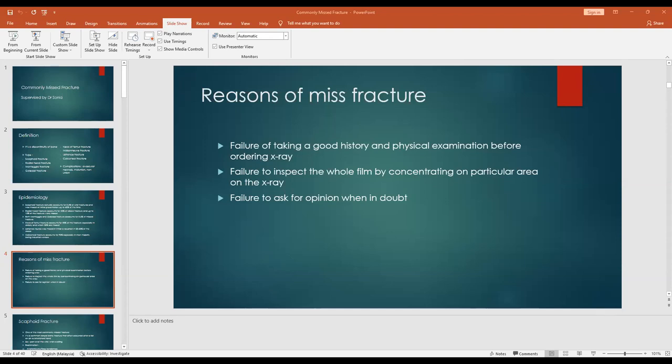Other than that, we go to the AP view. Imagine that you are driving a car across flat stones, so there is no white space between them. If there is white space between them, there is some dislocation inside the wrist. Look for any narrowing or overlapping.